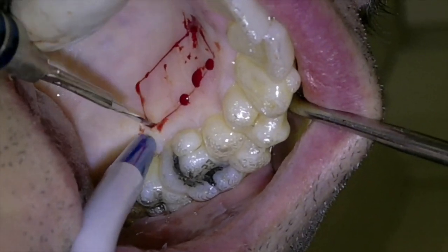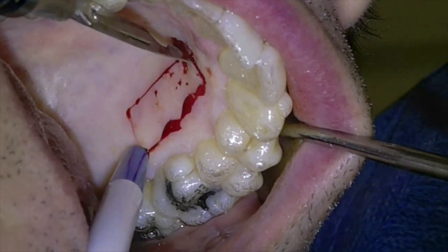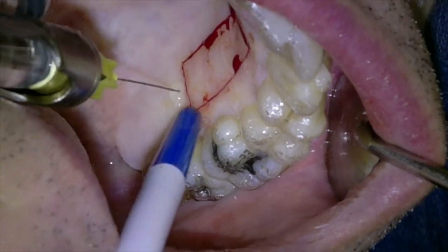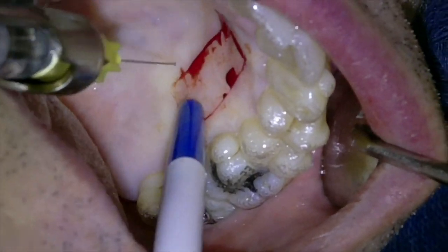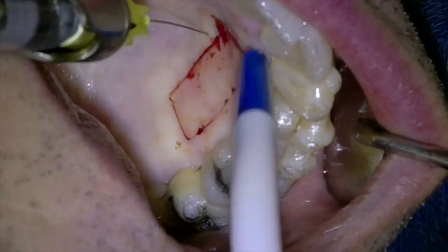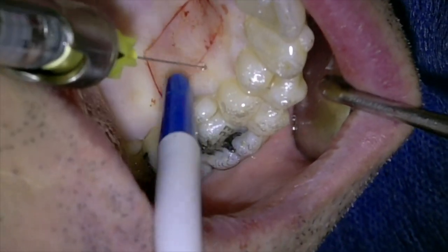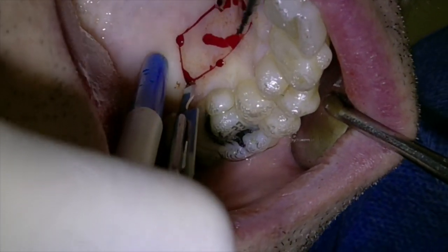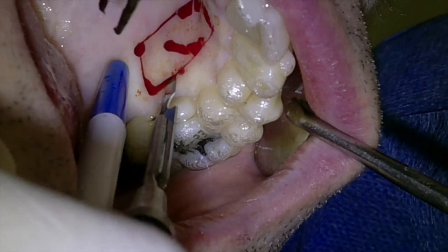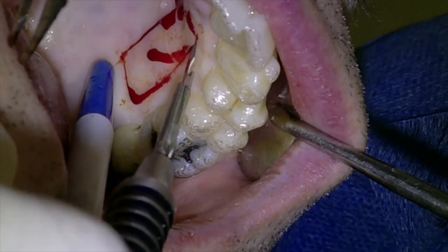Once you already have the epithelium, which covers about 0.3 millimeters, you're going to go a little bit beyond that epithelium, so you're going to go a little bit deeper. And if you see that it still keeps bleeding, you're going to use a little bit of anesthesia with a little bit of adrenaline, except with cardiac patients, where you avoid adrenaline. You're going to use anesthesia to block those blood vessels a little bit and have better access in terms of visibility and less bleeding.